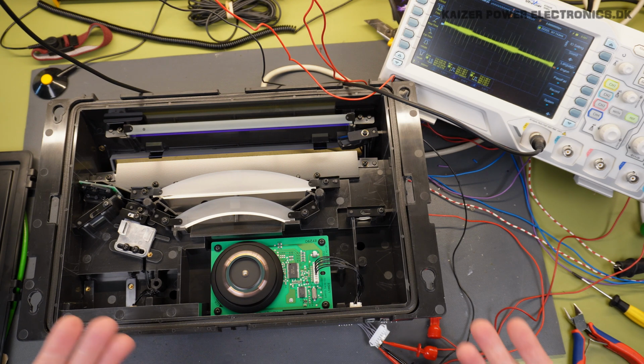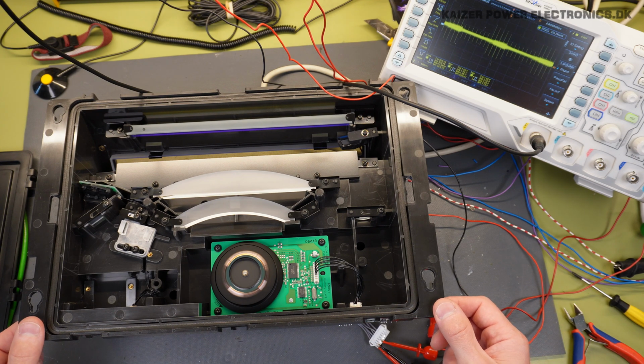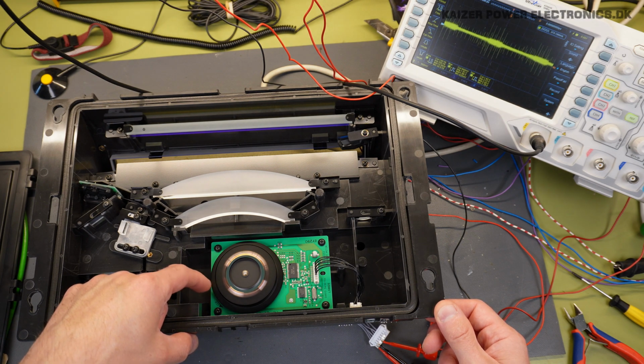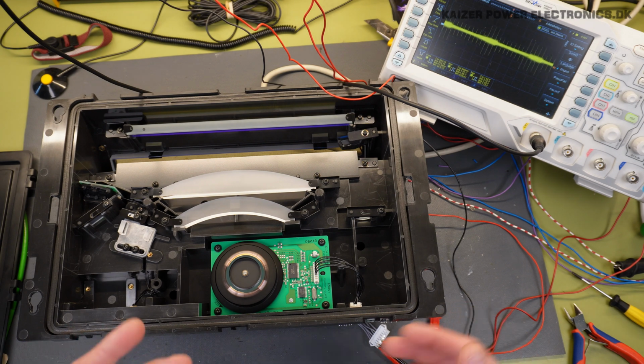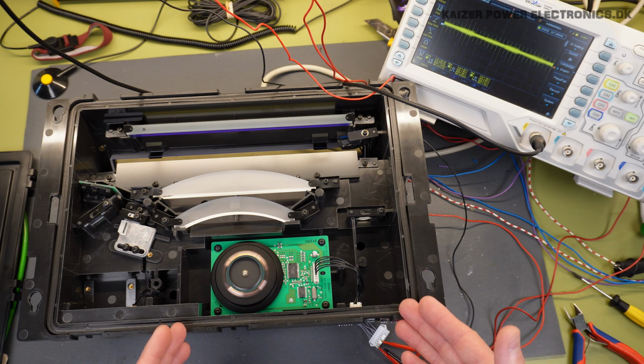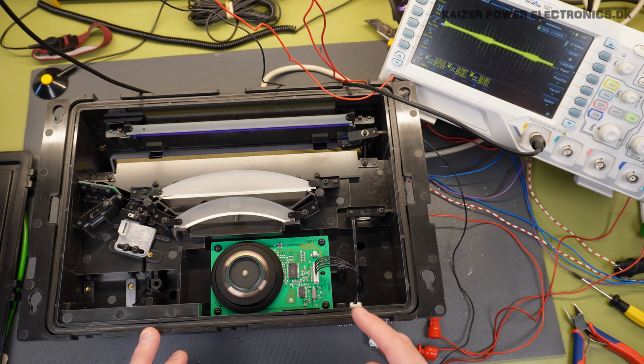So clearly I'm making the scanner motor run from pure interference of, I don't know, maybe 50 hertz. Because if I try to stop it, I can actually hear it starts regulating and tries to pick up speed again. So it is driving as it should. And it's probably for a set speed in a laser scanner like this that it cannot have a varying speed. With the state of the driver we have right now, this is how it's going to run.